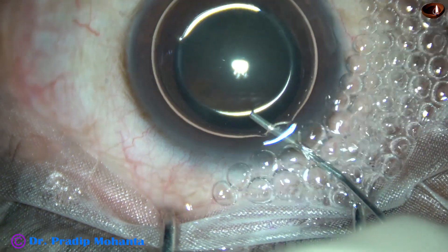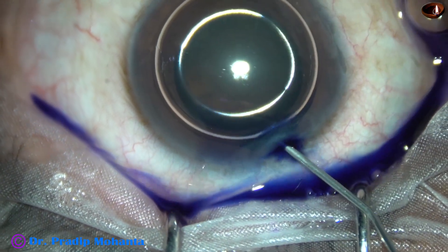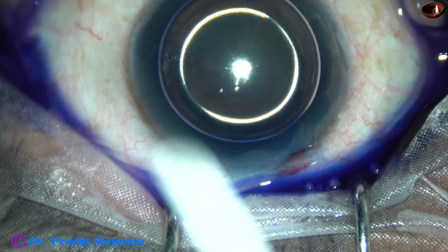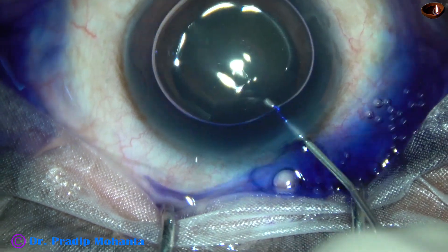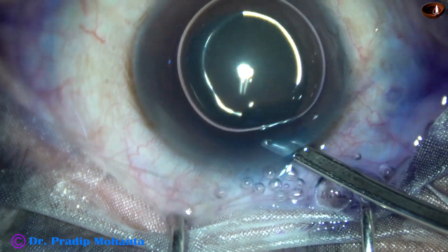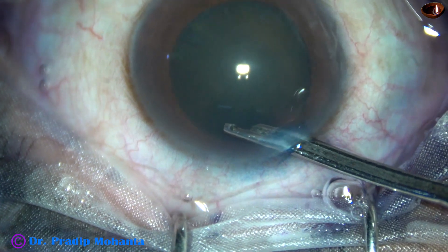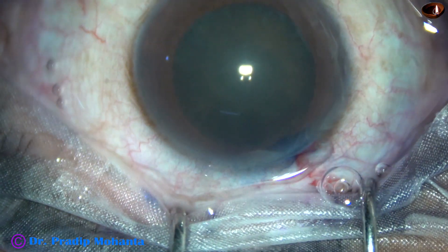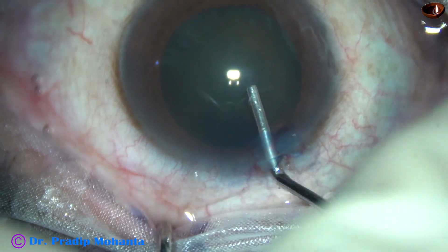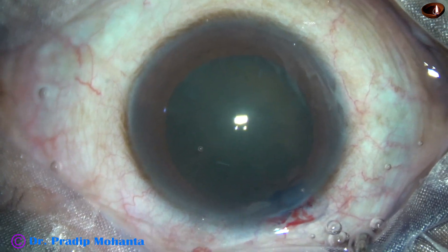Now I am going to stain the anterior capsule with trypan blue dye for better visibility so that I can do the capsulorhexis easily. Red glow is not good in this case, so I had to use this dye. Anesthesia is good, the patient is cooperative, and the anterior chamber has been filled with 2% HPMC.